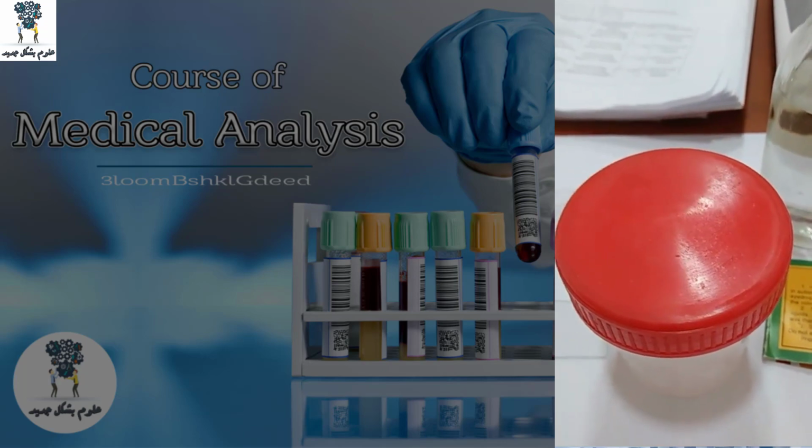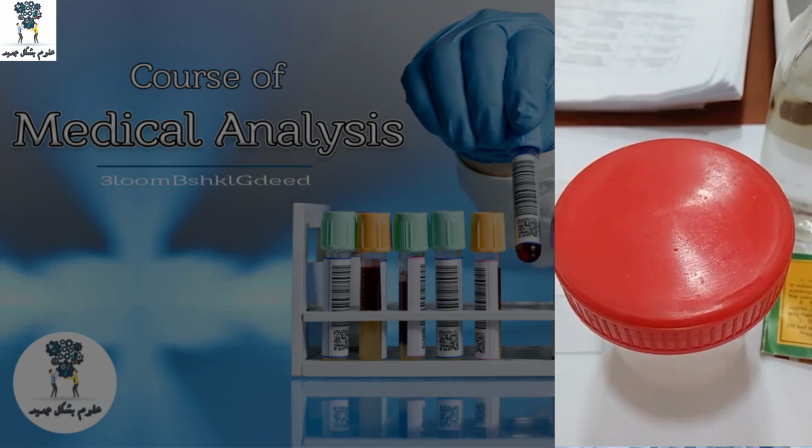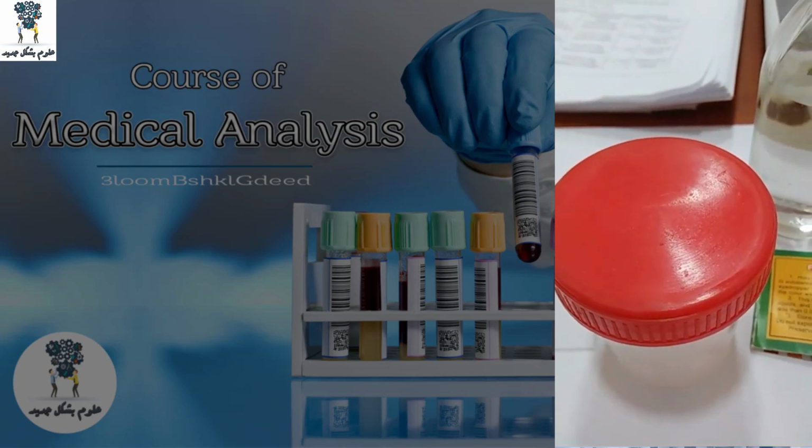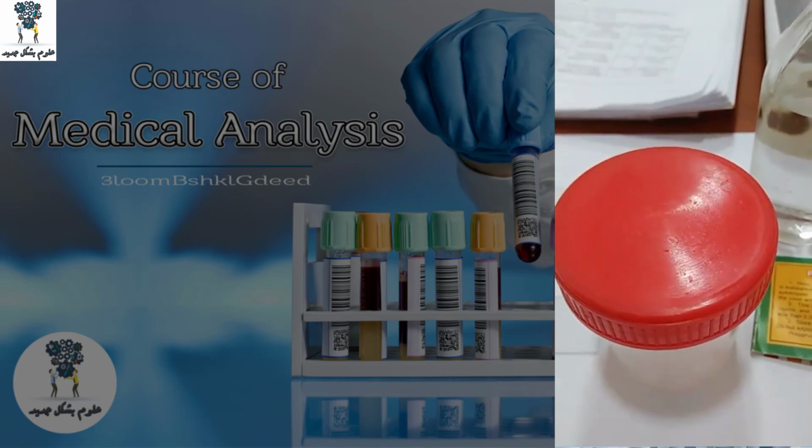So we should measure the volume. It is 3 milliliters, 4 milliliters, but not more than 7 milliliters. That is too much.